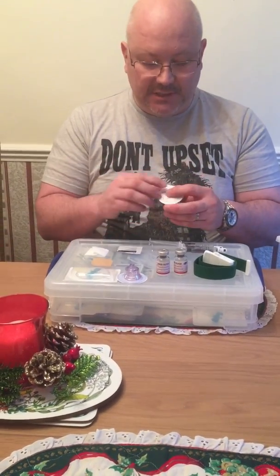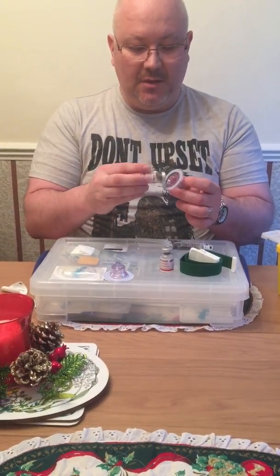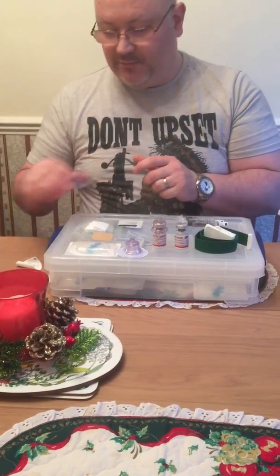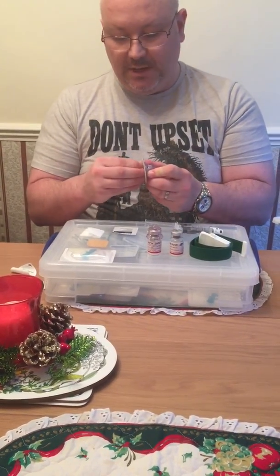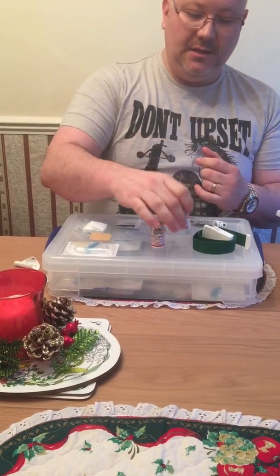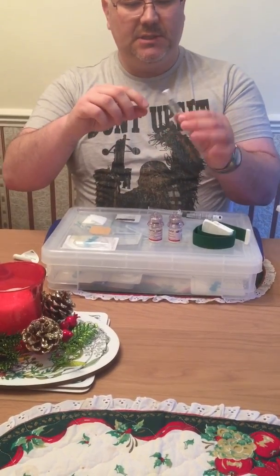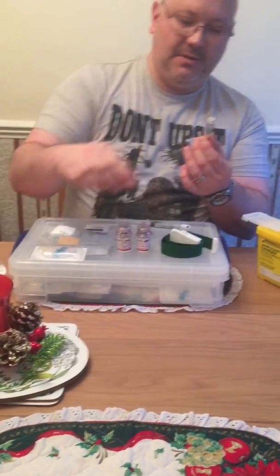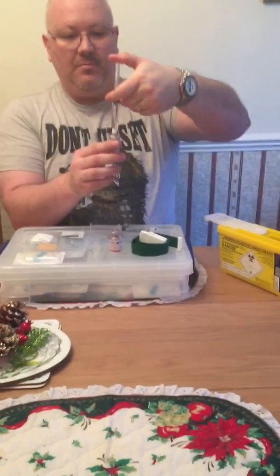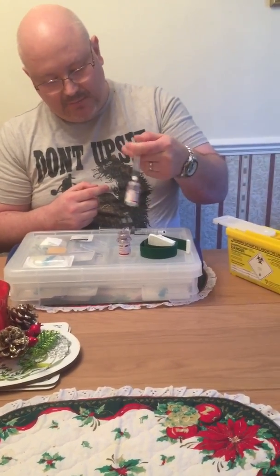Next I want to take the filter needles — remove the paper from the sterilised filter needle, there's a needle which clicks on and comes off with an attachment for the syringe. I'll do that for the second one as well. Now these are vacuum sealed, so when I put this filter needle in, that releases the vacuum. Now take the distilled water, snap the top off, pop that away, and screw and connect to the bottle. Push the plunger down so that the water mixes with the clotting factor and give it a little mix.